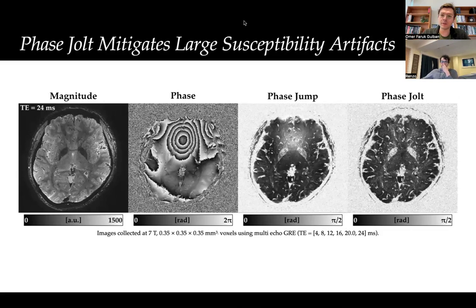Ömer, I have a question. Yes. Why is this ring in the middle here happening in the face? No, it is just a large susceptibility artifact. It happens in every MRI data set. Is it because of the sinuses? Yeah, it's the sinus thing. It happens in the cortex as well because of the ear cavities. Oh yeah, okay, thanks. Just to summarize, it's due to the large magnetic field susceptibility differences between large tissues like air and brain, and the phase gets messed up.